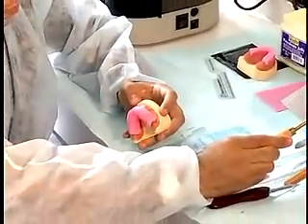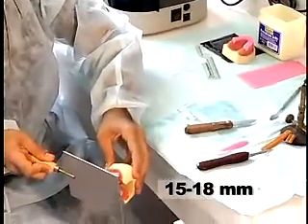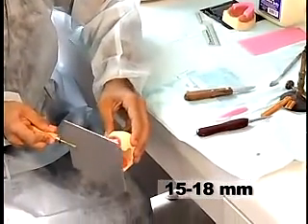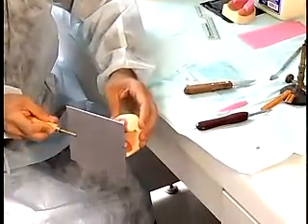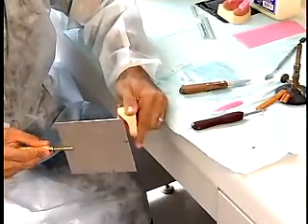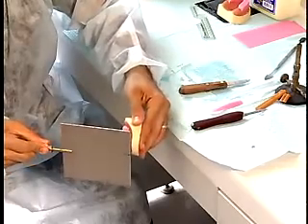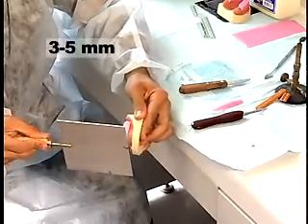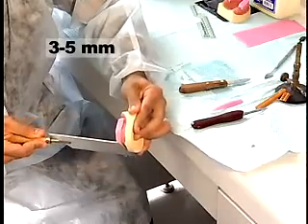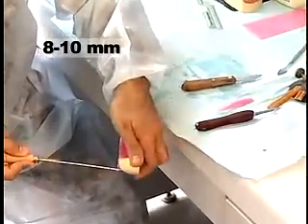Make the height of the rim about 15 to 18 mm from the anterior border to the incisal edge. The shape, position, and dimension of the rim should represent those of the natural teeth. Posteriorly, the occlusal surface gradually widens in width from 3 to 5 mm in the anterior region to 8 to 10 mm in the molar region.